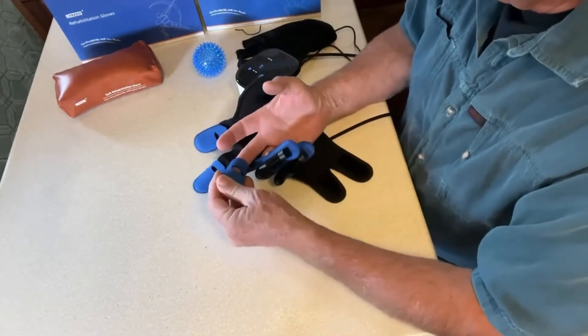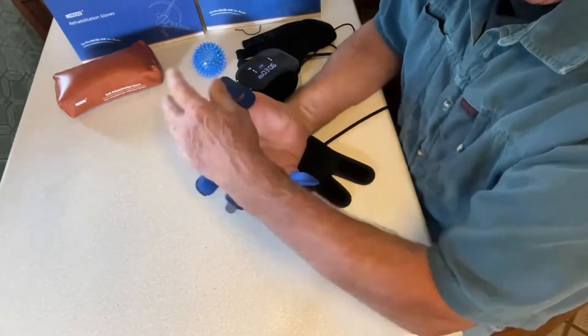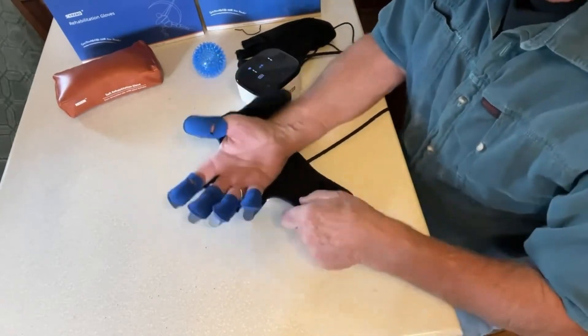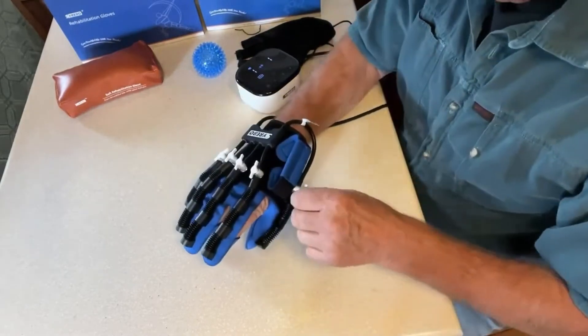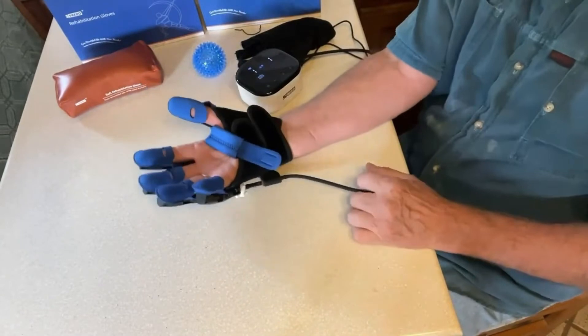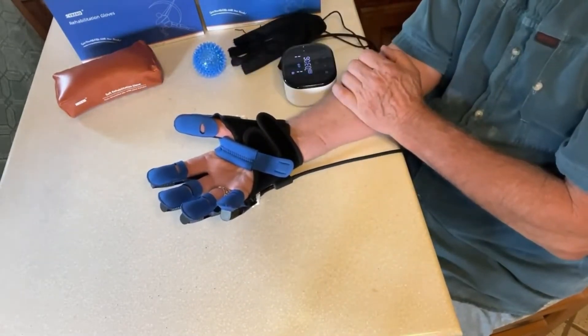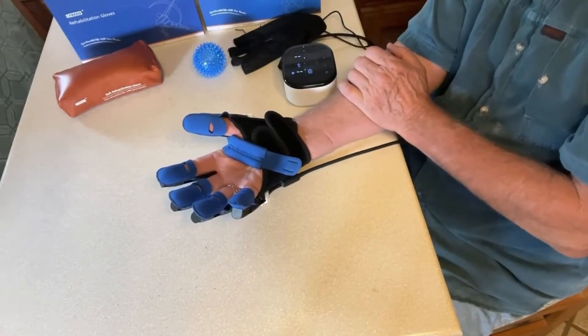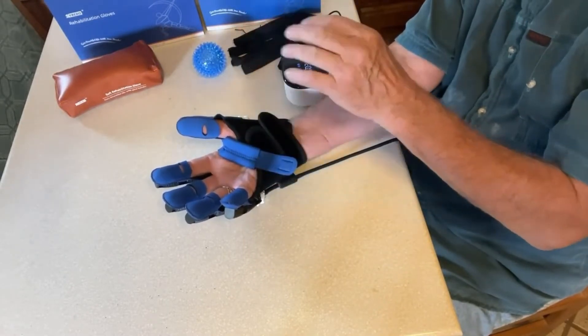This is a large — they come in different sizes. I've always thought of my hands as being medium, but it fits good. This goes over your wrist and there's a thing on the back that comes over and holds it. I'm just going to let you trust that I am, in fact, not doing this with my hand — it is the glove doing it. This is not a debilitated hand, but I'm not doing this.